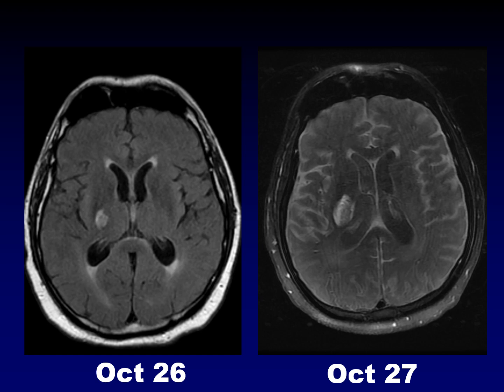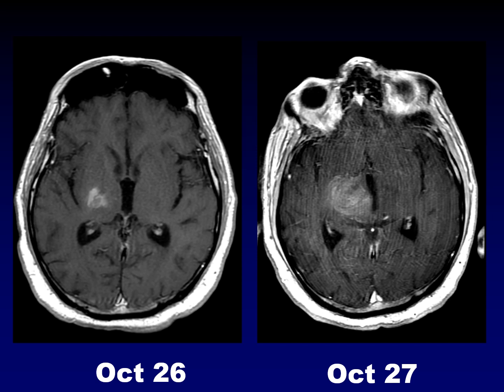Here's an image from the same patient 24 hours later. These are both FLAIR images, but look at the CSF on the new sequence — it is diffusely abnormal. This patient is not receiving any supplemental oxygen at the time of imaging. On the post-contrast images from these same two examinations, this area of abnormal enhancement has massively increased — it's probably volumetrically ten times as big as it was before, in just 24 hours.